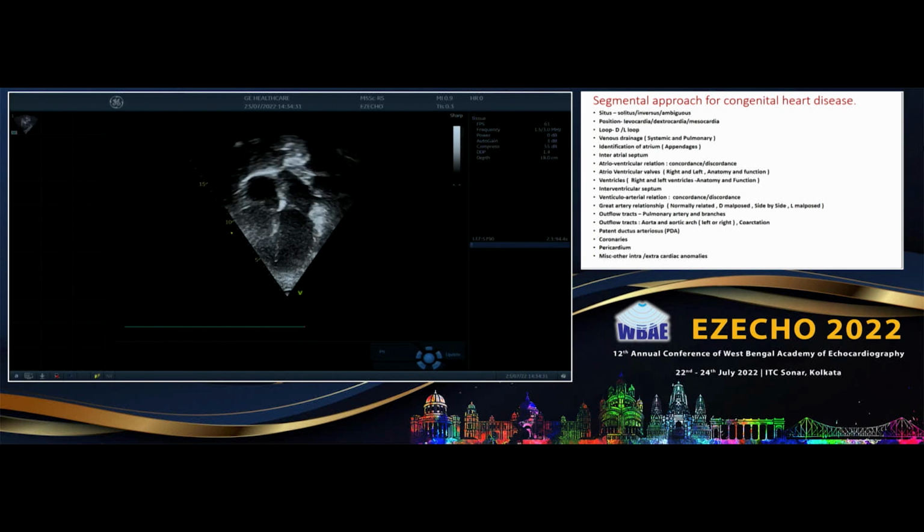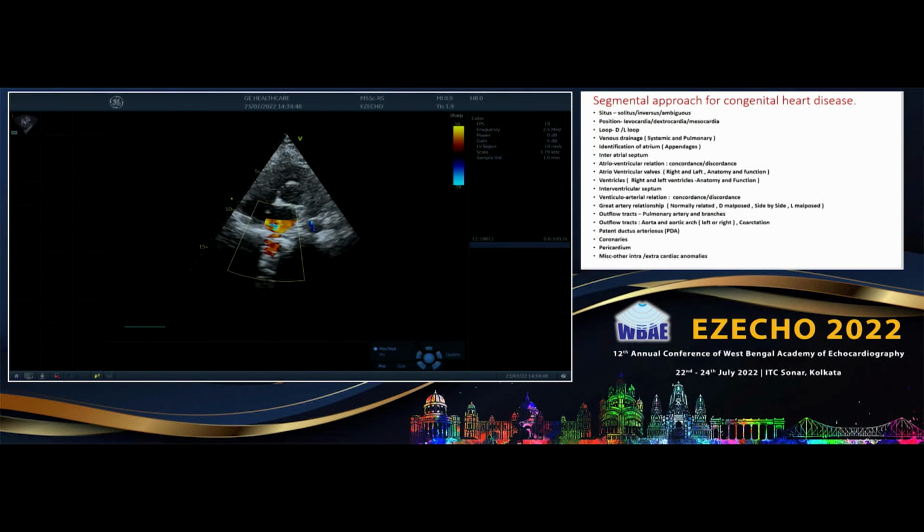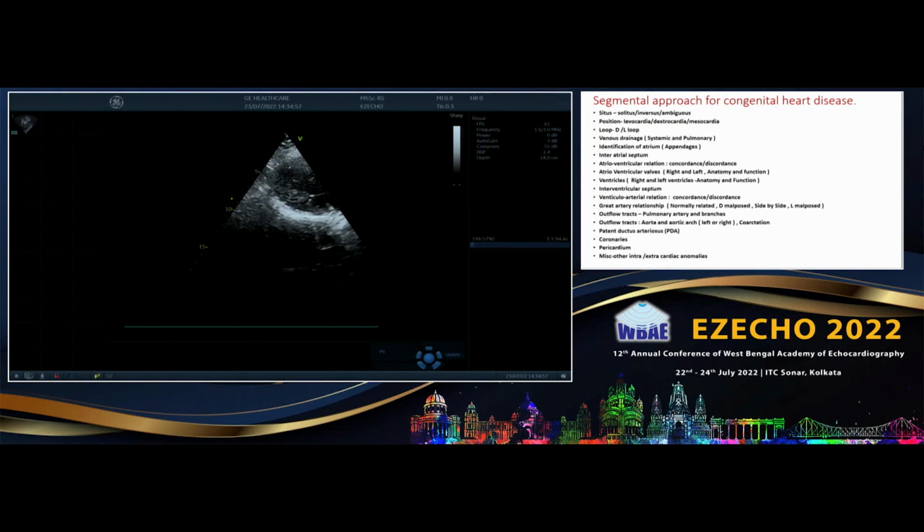Whatever you are getting as maximum, sometimes it overestimates. You are getting a gradient of 120, but the baby's pressure is only 90. So how is it possible? That is the overestimation in calculation. So what I do, more than 80. So I am correct, more than 80, but I have not put an absurd number like 123. I check BP also. So we sometimes can miss a hypertensive patient. It may be. We should check that one also. Thank you.